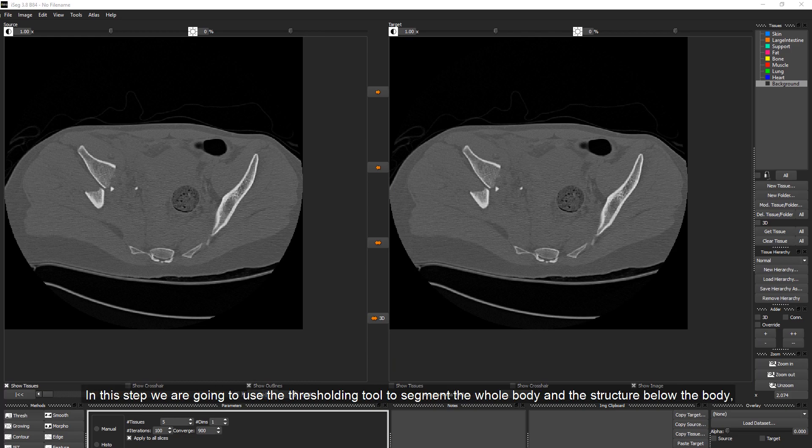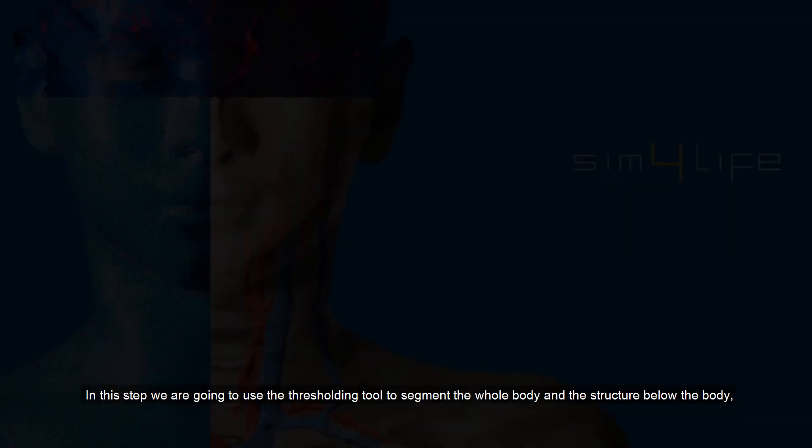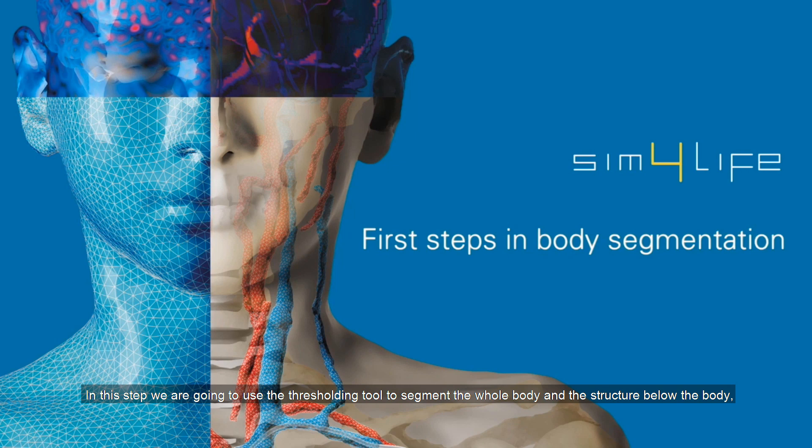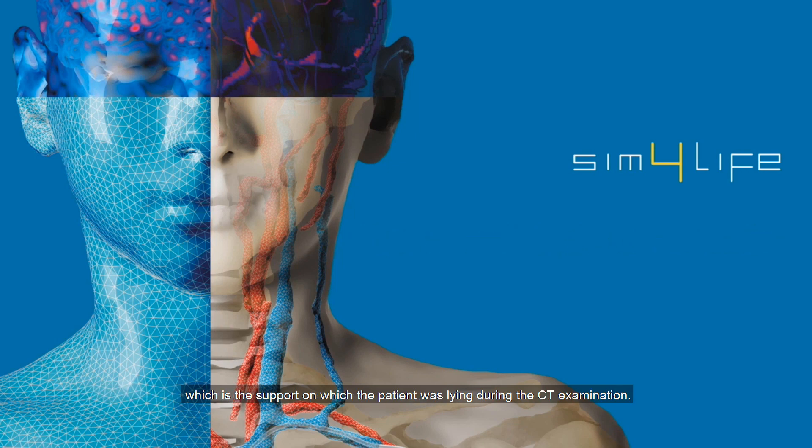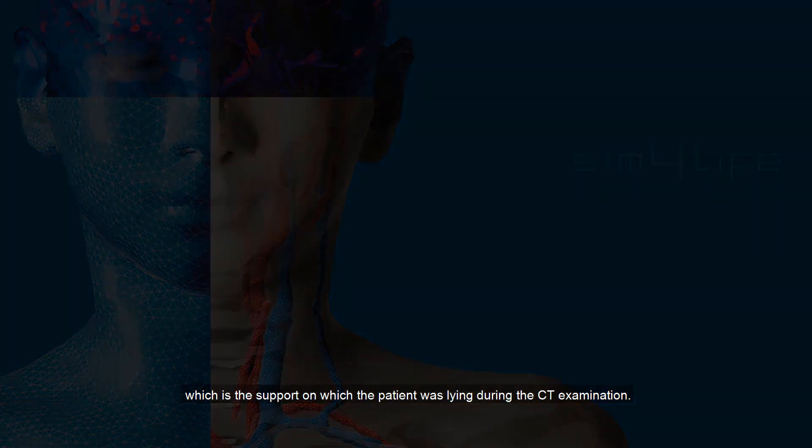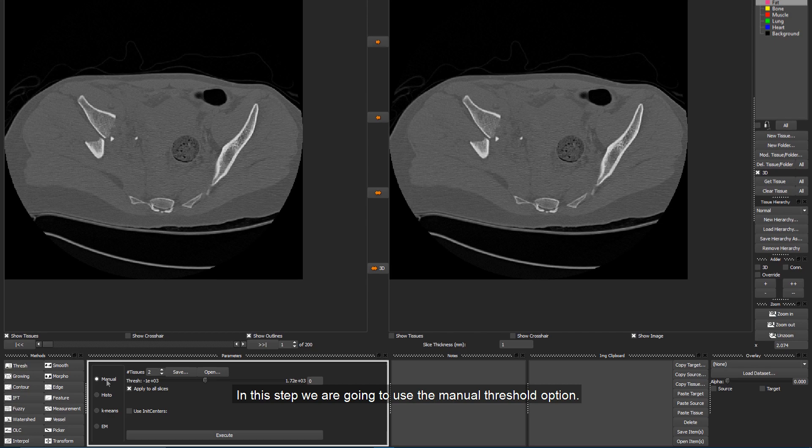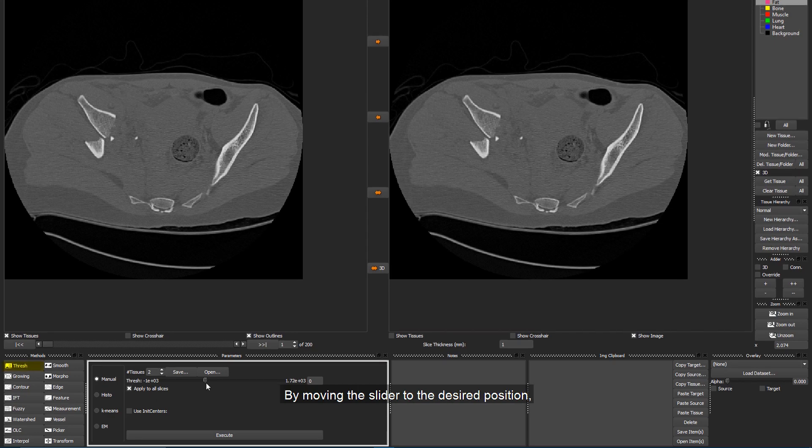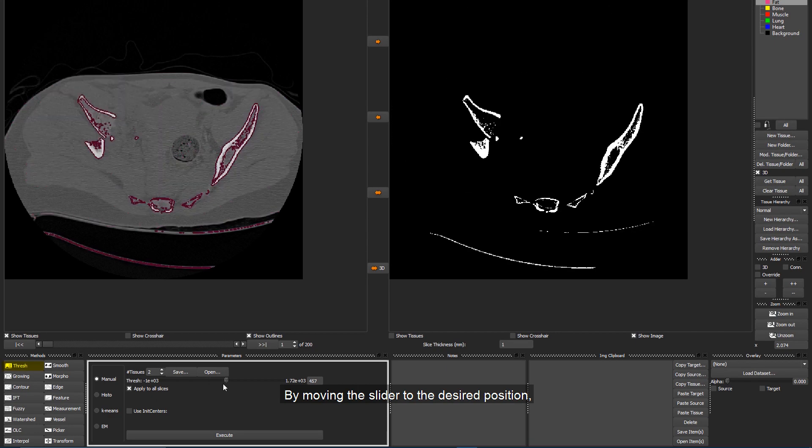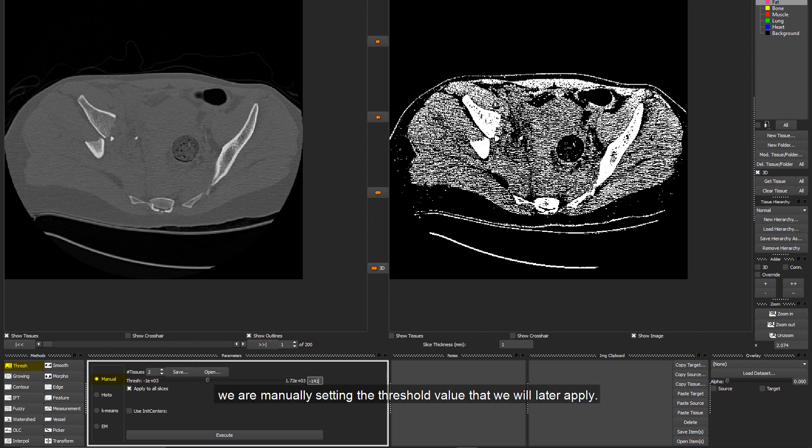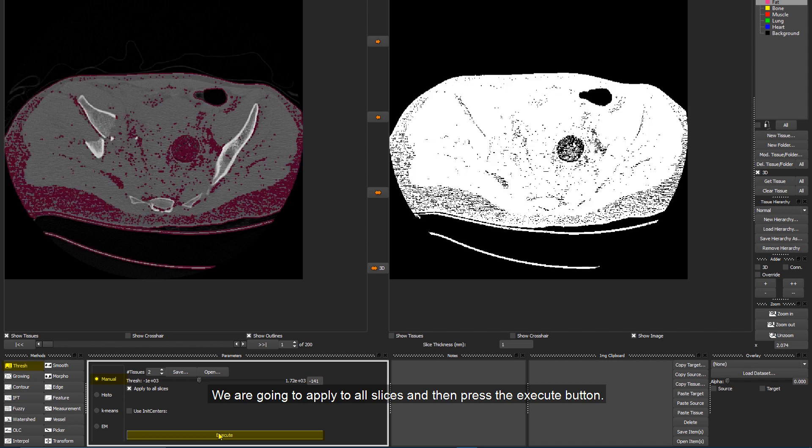In this step, we are going to use the Thresholding tool to segment the whole body and the structure below the body, which is the support on which the patient was lying during the CT examination. We are going to use the Manual Threshold option. By moving the slider to the desired position or by entering a specific value, we are manually setting the threshold value that we will later apply. We are going to apply to all slices and then press the Execute button.